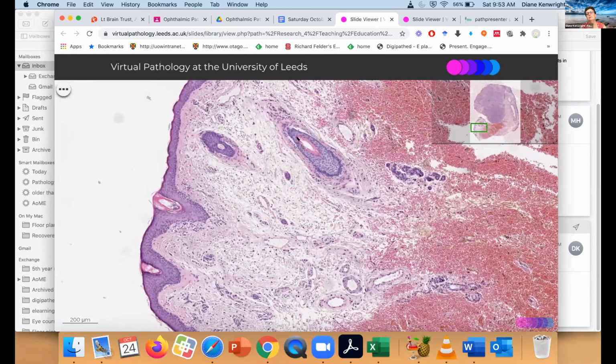Yeah. So with skin on one side and conjunctiva on the other and this characteristic shape, we know we're at the eyelid margin. And then at the eyelid margin, we've got this large purple looking tumor. And the place that it's in is it's in the dermis, okay? And it's like the tarsal plate coming through here and the eyelid muscle down the bottom coming through here.